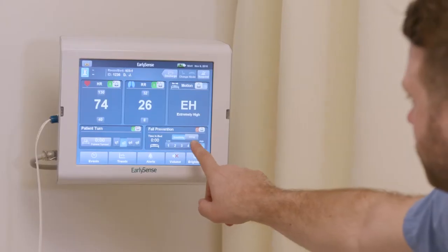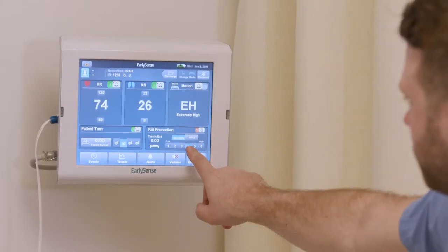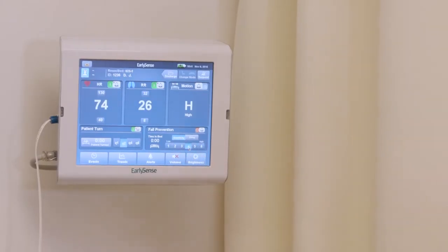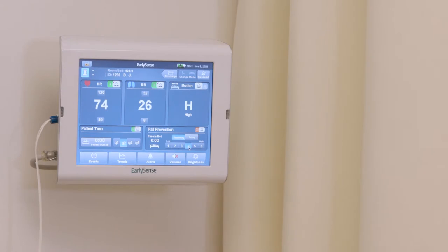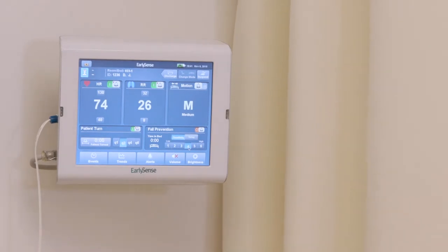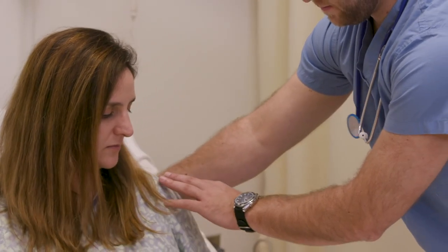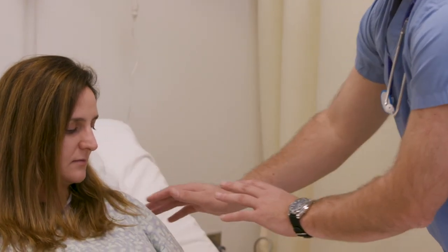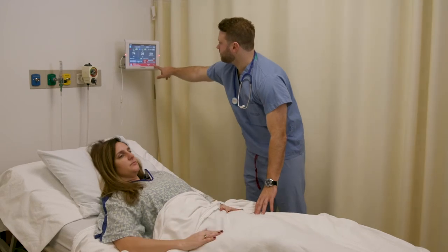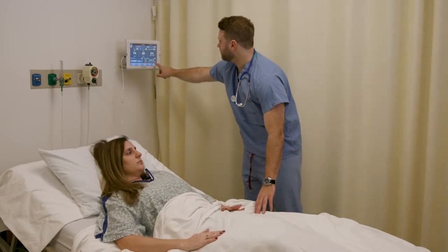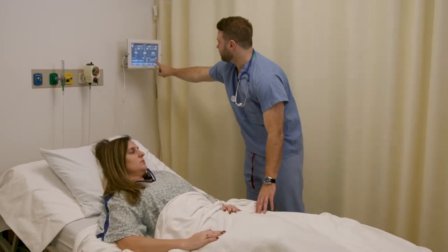To change the sensitivity, simply press on the value of your chosen sensitivity on the touchscreen. Adjust the sensitivity to the condition of your patient by observing his or her behavior.